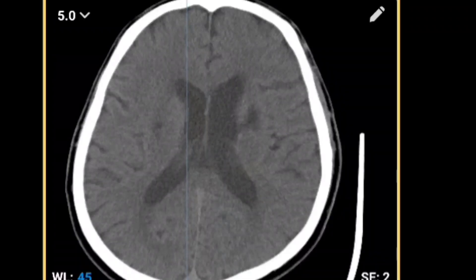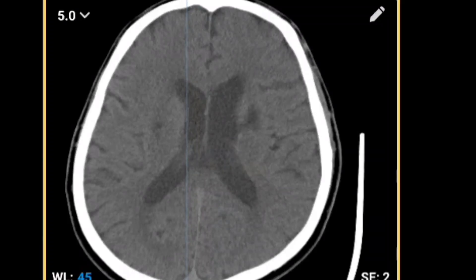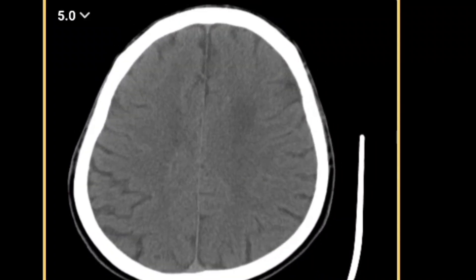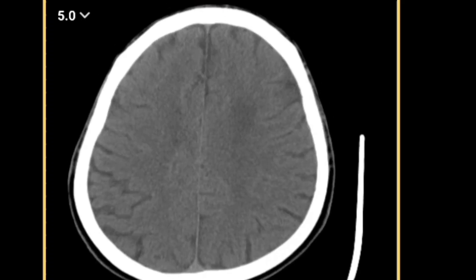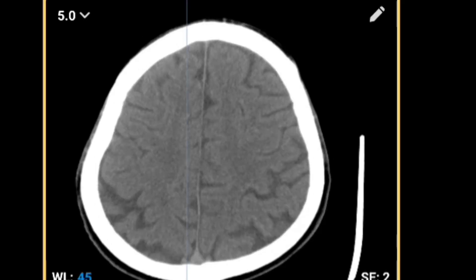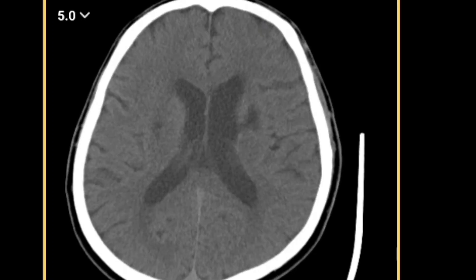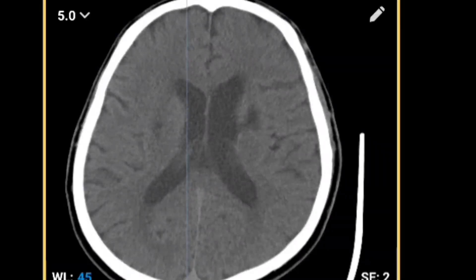Normally this area is supplied by the middle cerebral artery and its perforators. As far as the basal ganglia is concerned, this is the particular territory of the middle cerebral artery perforators, so this is called a basal ganglia infarct due to perforators of the middle cerebral artery. Going upward, the ventricular system is slightly dilated, the sulci are deep, and the gyri are prominent due to atrophic changes. Going back to the diseased area, this is a small infarct affecting the left side of the basal ganglia.